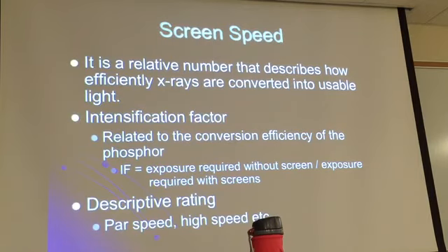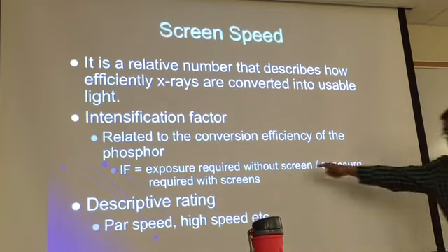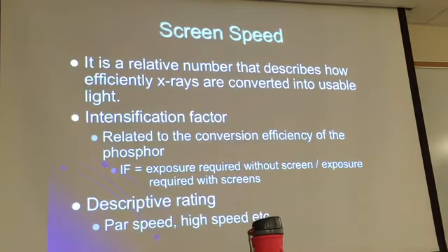So you make the same exposure using the same technical factors, and you report a number. Let's suppose that number was, just a number that came to my head, 3.57 roentgens. That's the exposure. So this number will go on top.